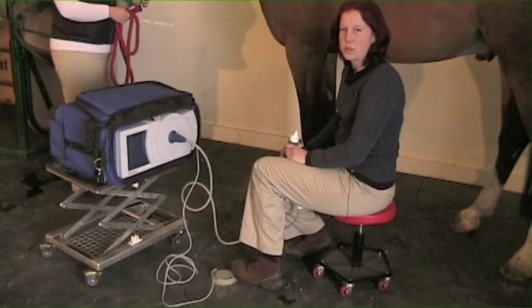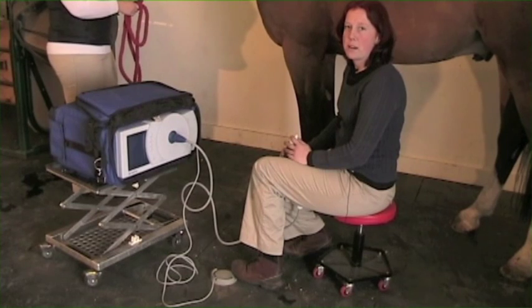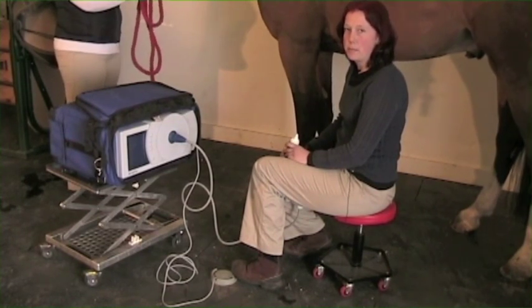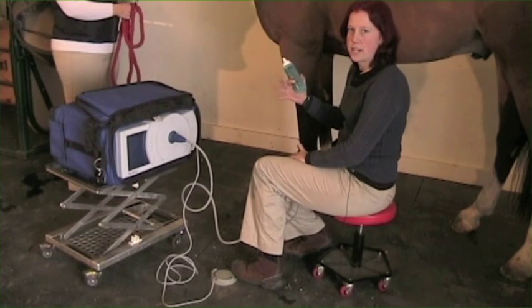So here we are with our patient. We're going to be shockwaving his left front lateral, or outside, splint. Typically, what we do with our patients is that they would be sedated, because this can be painful, especially if the area that we're shockwaving is painful. The area is typically clipped, and we use ultrasound gel, which will increase our contact with the skin and allow for better penetration of the sound waves.